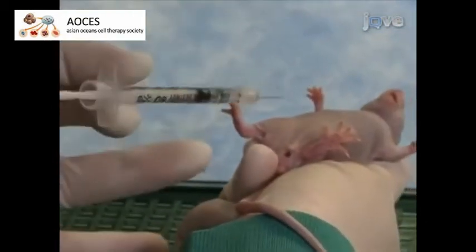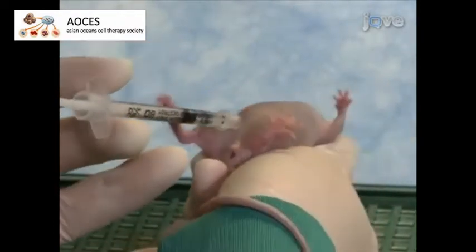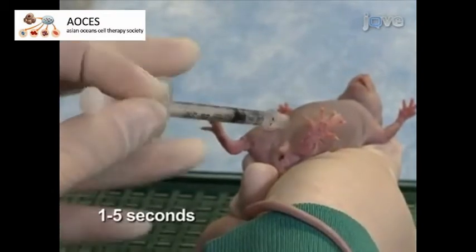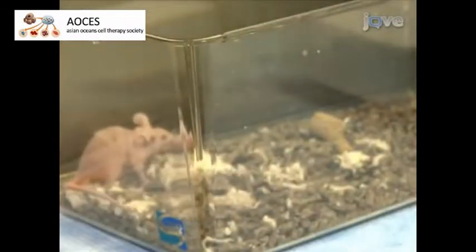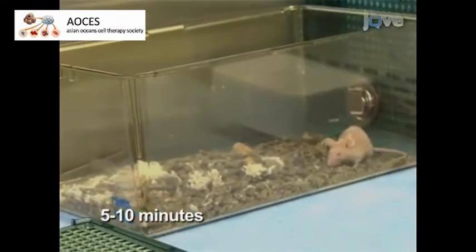Insert the prepared syringe needle at a 30-degree angle into the lower left quadrant of the mouse. To ensure that the needle is in the intraperitoneal space, pull back on the syringe plunger. If no fluid is aspirated into the syringe, then inject the syringe contents with an even pressure over 1 to 5 seconds. Release the mouse. Monitor the mouse for 5 to 10 minutes after the injection to ensure that it returns to normal activity levels.